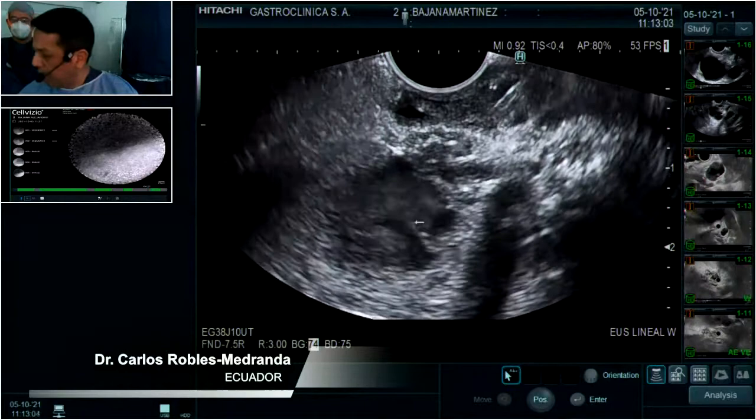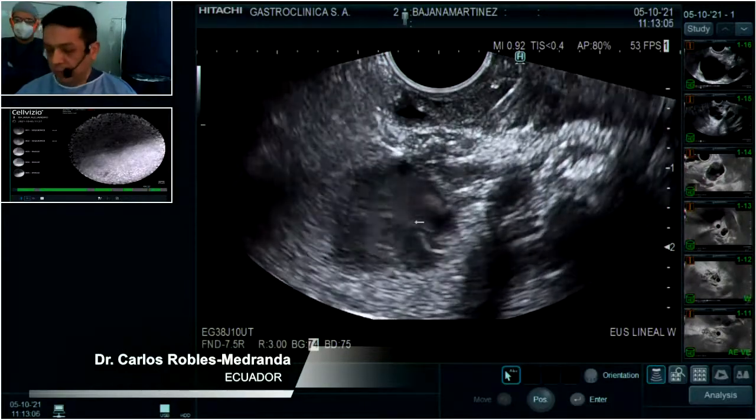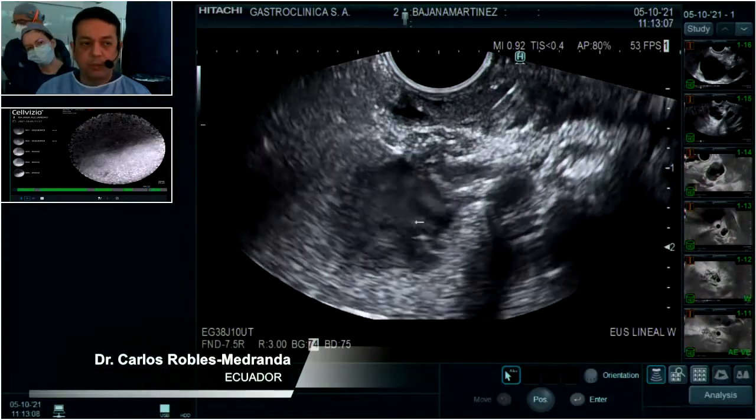Yeah, we have tissue here. Okay. I will do an aspiration, I will finish.